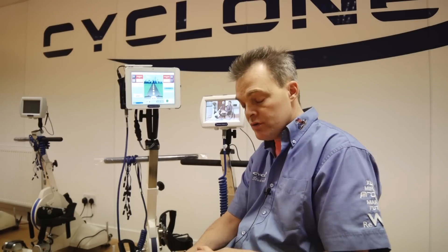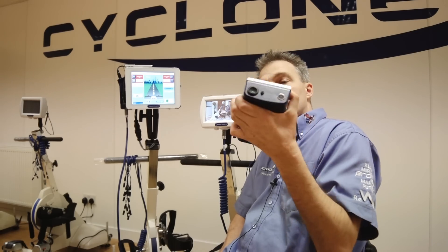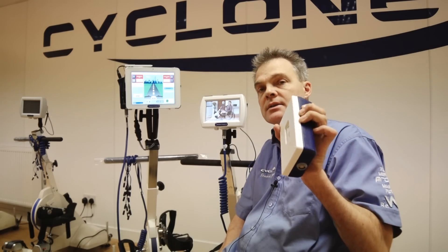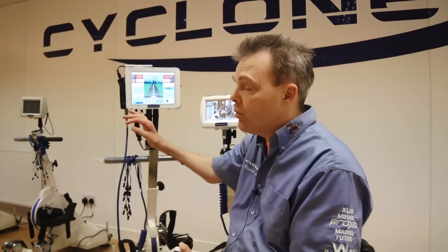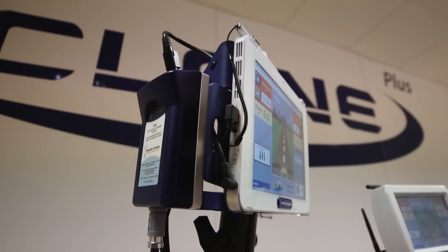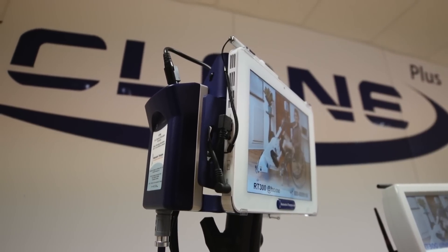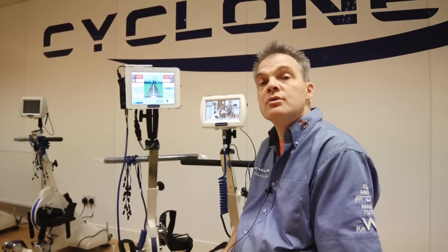We're using separate stimulators. This is one of the stimulators — this is the right-hand side one, and up here we have the left-hand side stimulator. This means that we can have either six or twelve channels as standard on the RT200 and RT300 devices using cables.